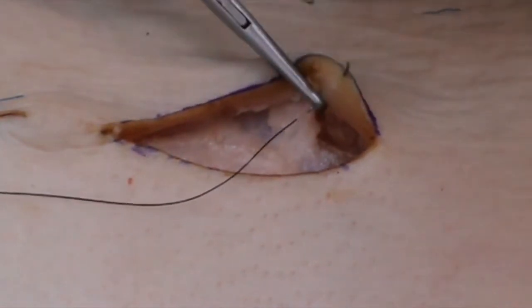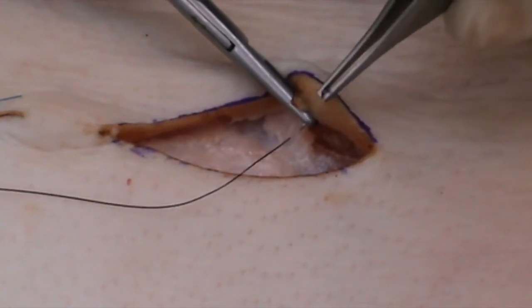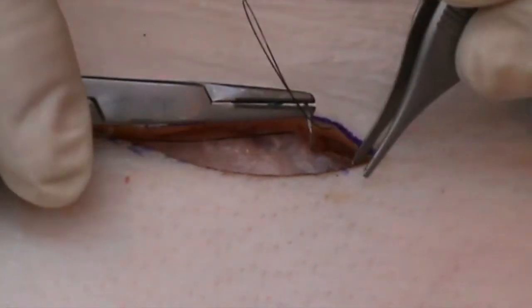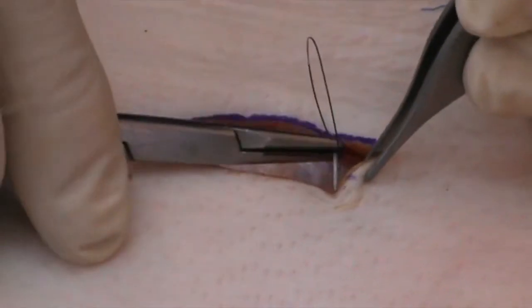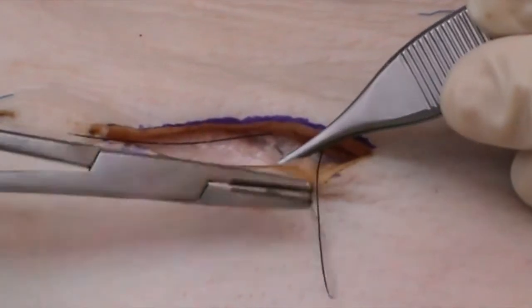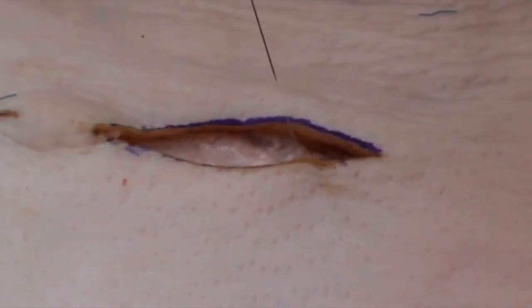Here we are going from deep to superficial, just below the epidermis. And then, on the other side, with an equal bite from superficial to deep. Remember, as you take the suture out, it's curved, so you rotate it out and that way there is no tension.